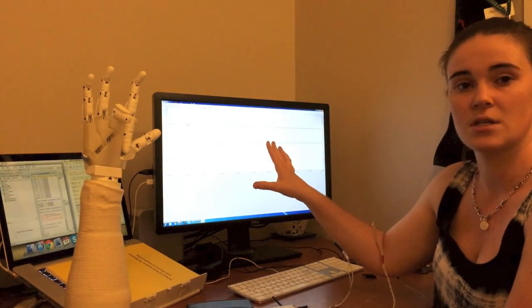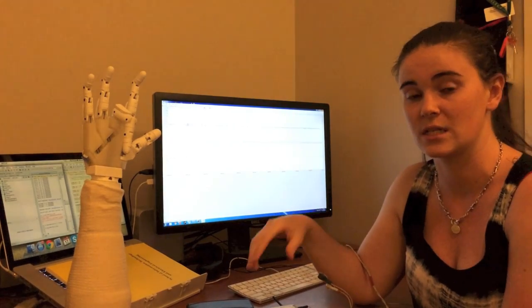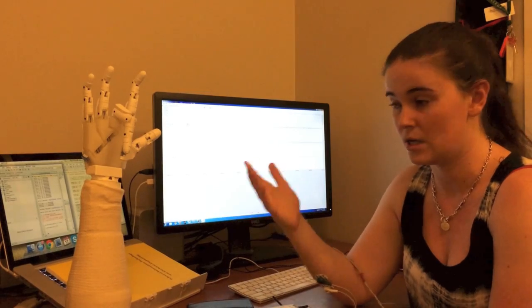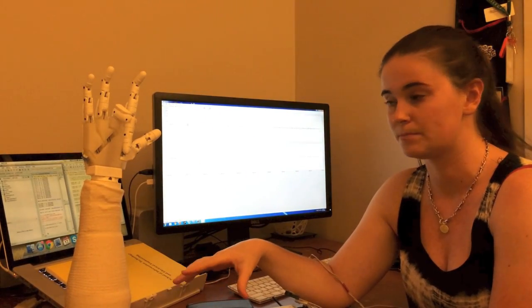So using that basic truth table style approach, I wanted to use that to initiate motion in the arm. So this data that I've gathered here is saved, and I then go through quite a few processing steps to clean up the signal to be used in the prosthetic arm, because the arm can only use digital signals.